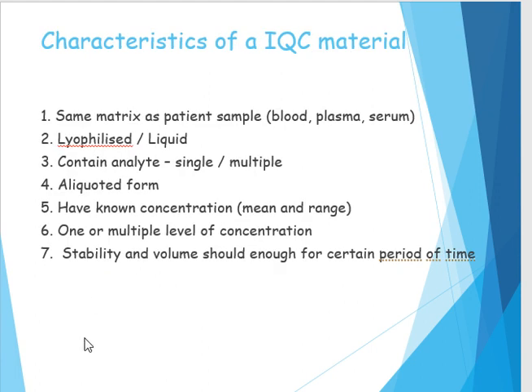Example, you buy the reagent and analyzer from company A, but you buy the QC from company C, something like that. So what are the characteristics of IQC material? These are the characteristics of IQC material.